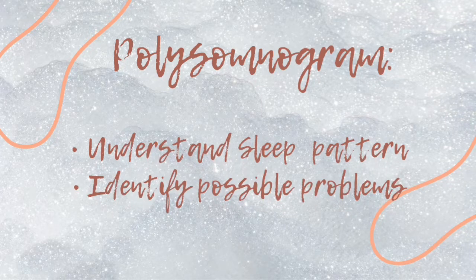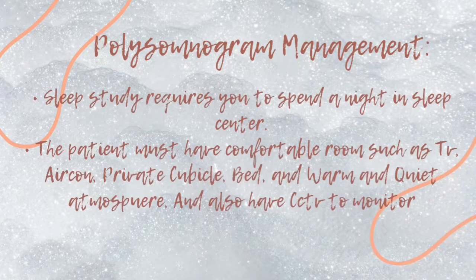In polysomnogram management, you will be required to spend a night in a sleep center, and the American Academy of Sleep Medicine has accredited sleep centers since 1977. The patient must have comfortable rooms with a TV, aircon, private cubicle, bed, and a warm and quiet atmosphere, and also have CCTV to monitor.